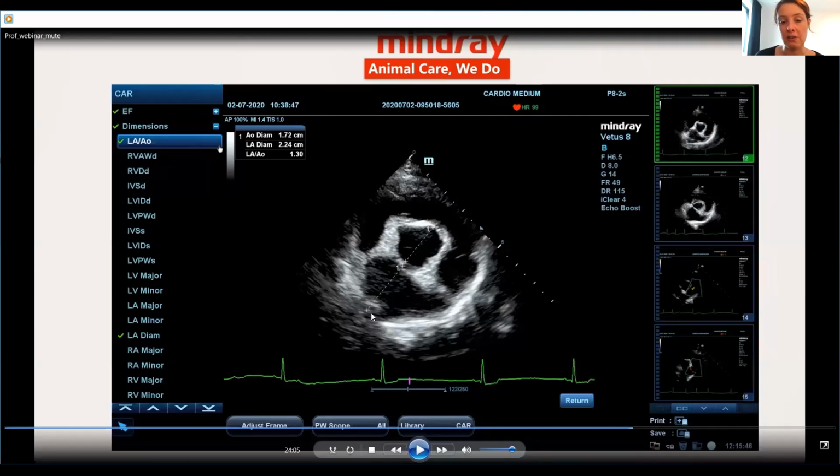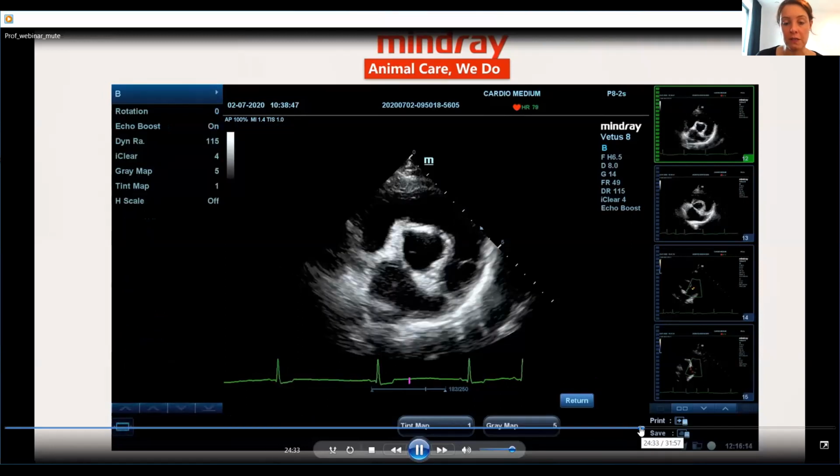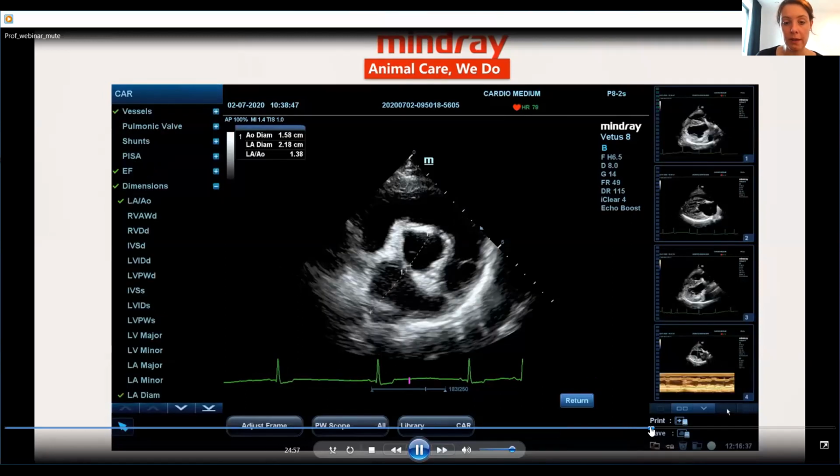You see here it's not clearly delineated, and you should probably not measure all the way up here, and also probably not all the way up here. It's probably around this. It's not a problem for this dog because this dog is obviously completely normal, and I have an LA/AO of 1.3. So this is not an easy measurement, and for this reason we will also measure the left atrium from some different views. Here I'm explaining again that the delineation is not perfect. Okay.